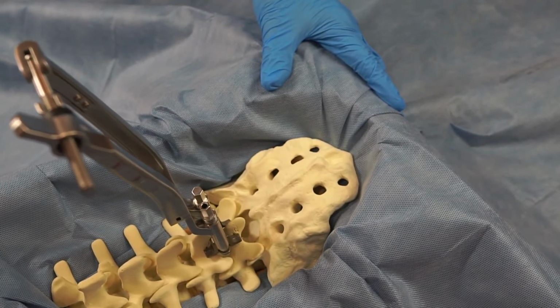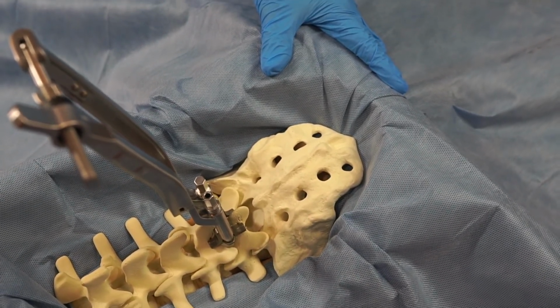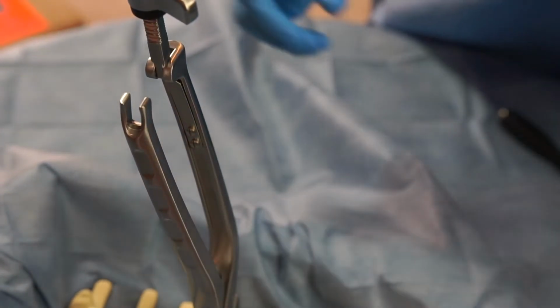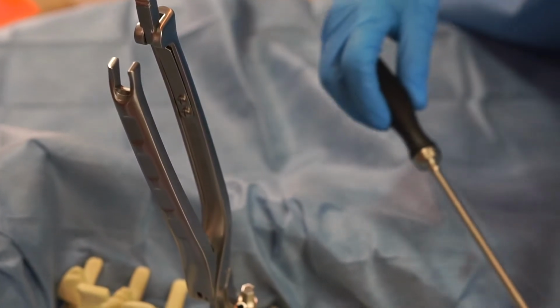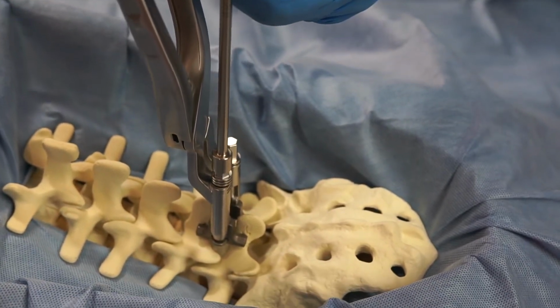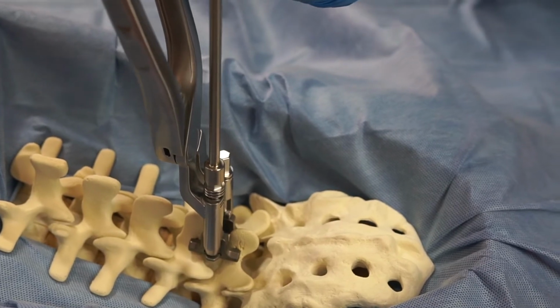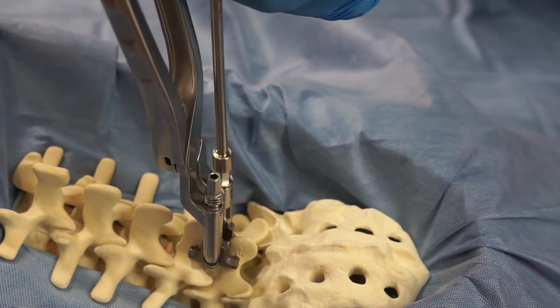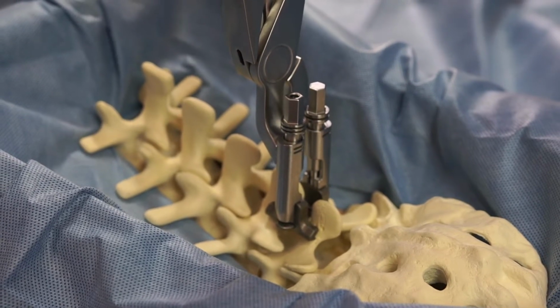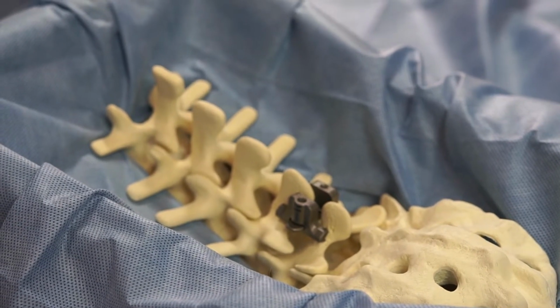Final confirmation of the implant placement can be made with the appropriate imaging tools. Disengage the PG inserter compressor by lifting up the ratchet arm and then completely loosening the hex screws on each side of the implant with the hex driver and remove from the surgical site.